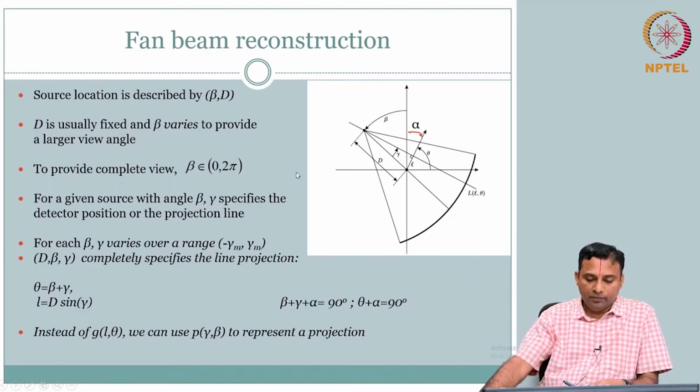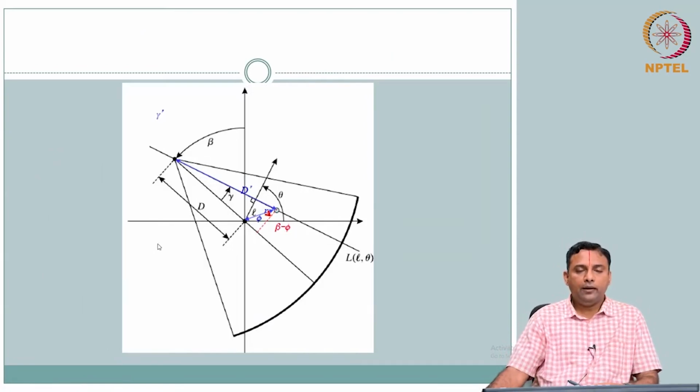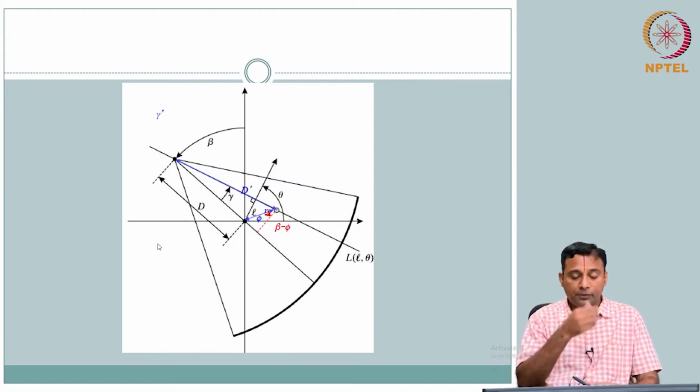So now you have to maneuver this, and then it's the same filtered back projection that you are going to use. The only thing is, you now have a geometry where you have defined where you got the data, so you have to project it back along this geometry. That is the key. So you can do that for both filtered back projection and convolution back projection. Both you can derive, starting from the equation and substituting these changes.